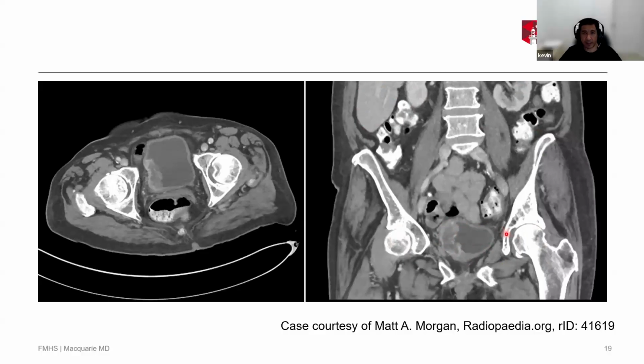So there's a couple of things I can say about this. Firstly, this is done with contrast. So we've injected contrast into the patient, and there's a certain timing as to when organs opacify. The standard is approximately 90 seconds after injection of contrast to get an image like this. And that's typically when most organs opacify optimally. There are a few variations on that.